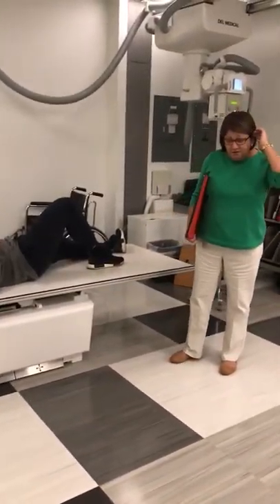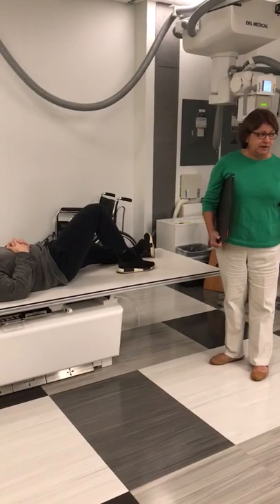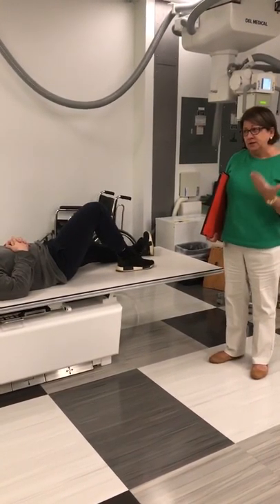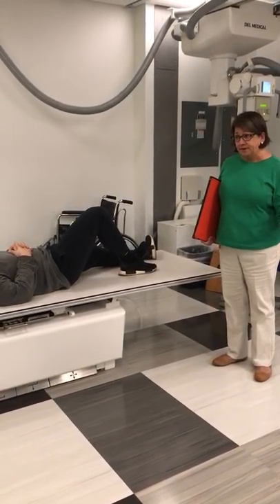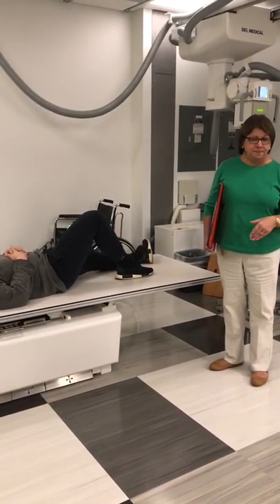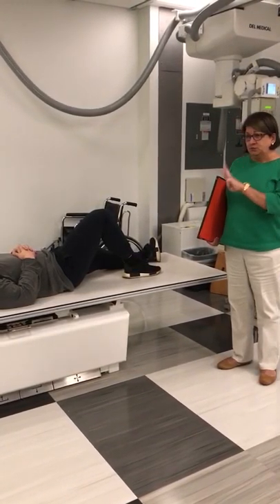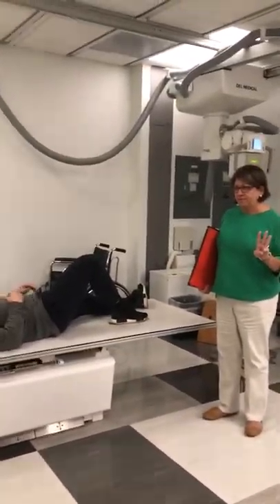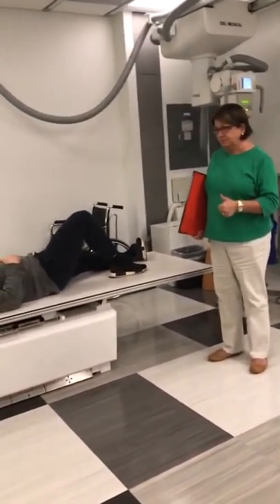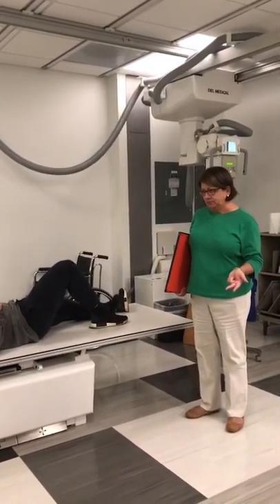So as I explained in class, what I'm going to demonstrate are the post-fluoroscopy or overhead positions, projections for both the esophagram and the upper GI. The esophagram exam has three positions, projections. You'll perform for that exam the AP, the RAO, and the right lateral.